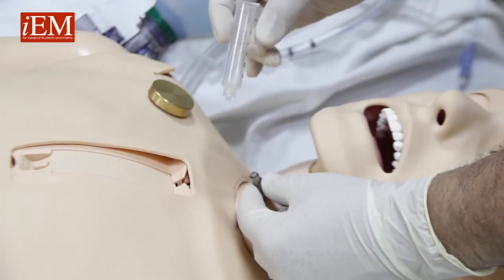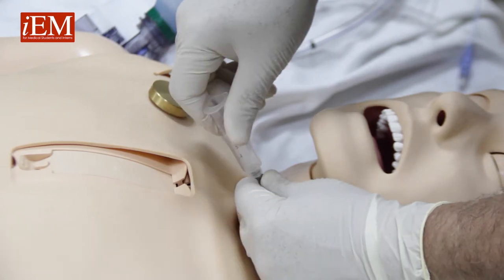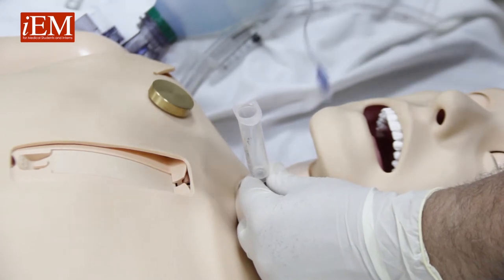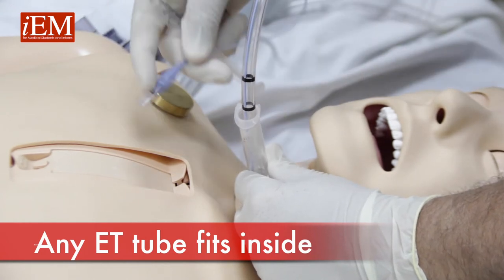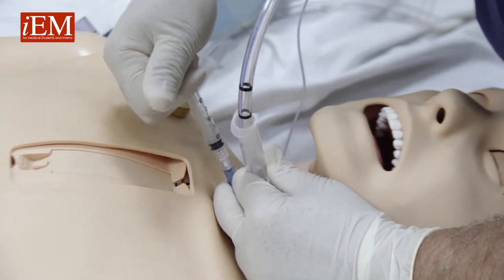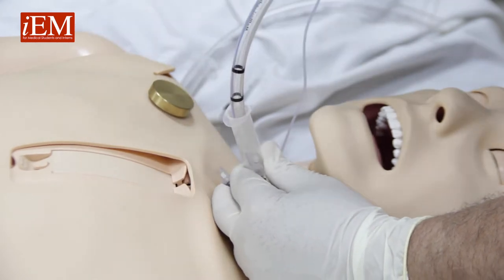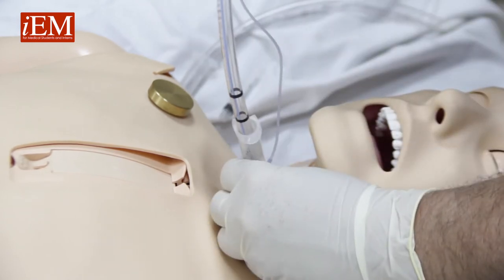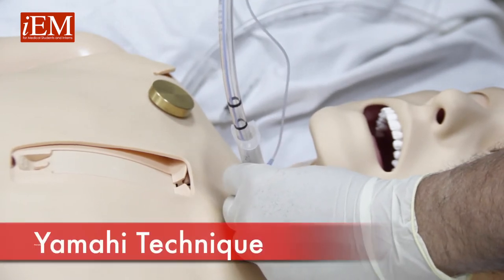Another option is you can take any syringe, okay? You connect it to your cap, remove the hub, the plunger, and take any endotracheal tube that fits inside, and you can inflate the balloon. And now you can see it's fit tight. And now we can bag the patient from here with that. This is called the Yamahi technique.